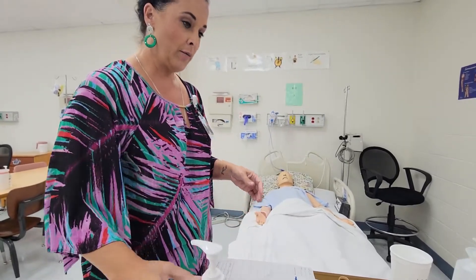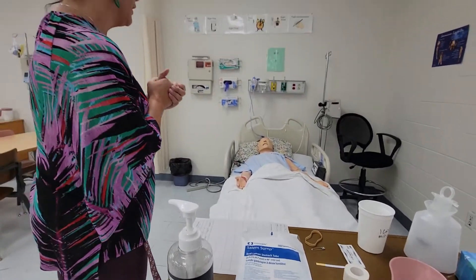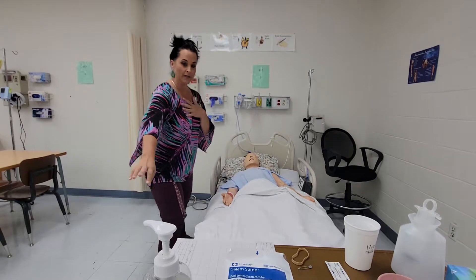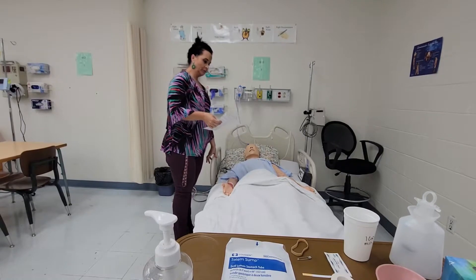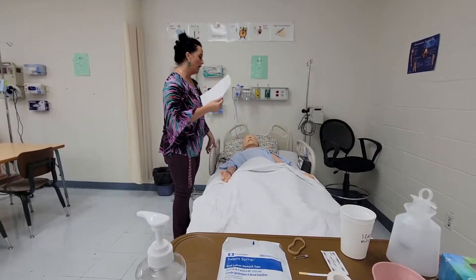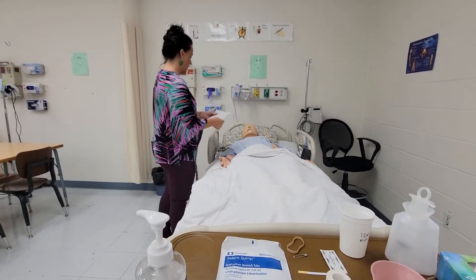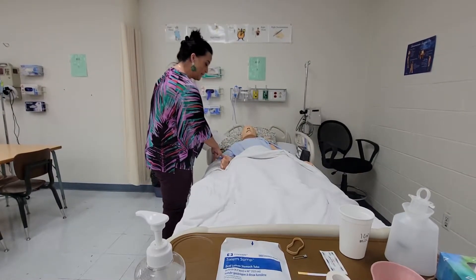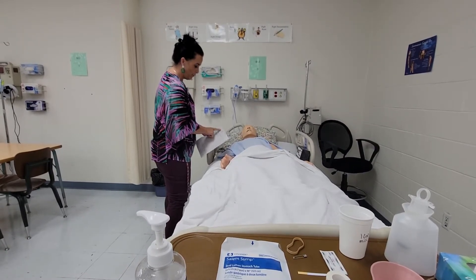The first thing I'm going to do is knock on the door and do hand hygiene. Good morning, my name is Talena, I'm going to be your student nurse today. I'm going to take my order and raise your bed up. You want to have your order in hand because this is how you verify the name and date of birth — I'm looking at the band on the arm and the doctor's order to make sure we have the right patient.